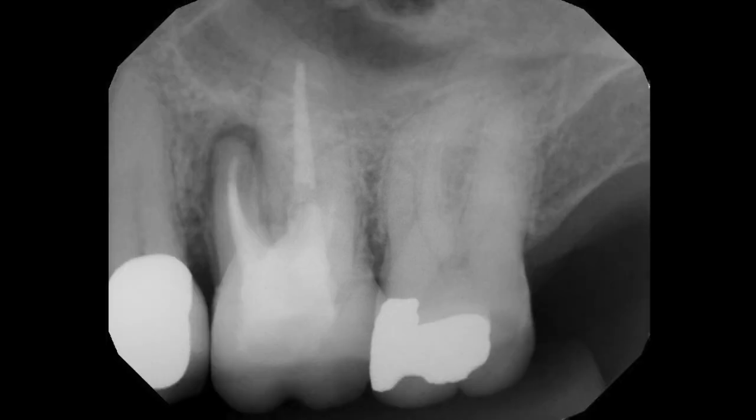We often are presented with teeth that are non-restorable, and we will anesthetize the patient and try to remove the teeth as atraumatically as possible.